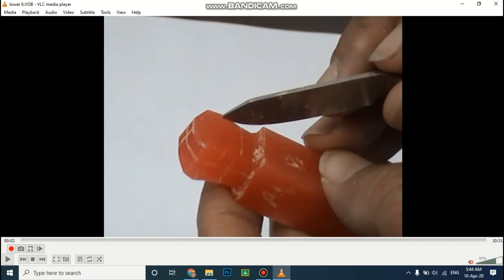the second difference between upper and lower 6 is that the intercuspal distance proximally is not divided equally as in the case of upper 6, but here it is divided unequally, 2 mm away from the midline buccally and 4 mm away from the midline lingually, creating lingual inclination. Thus the differences between upper 6 and lower 6 in the first and second steps are the measurement creating a wide tooth and the lingual inclination.